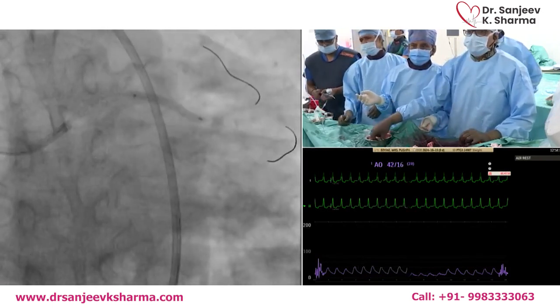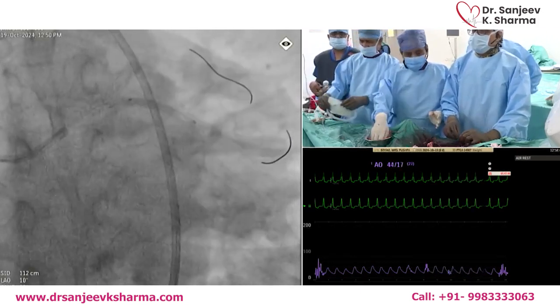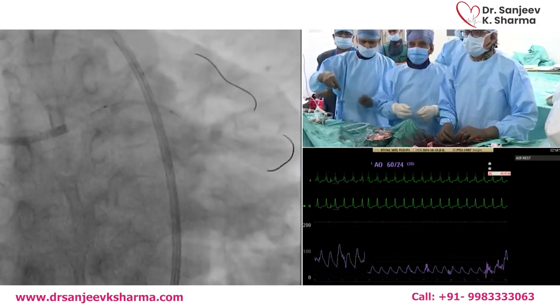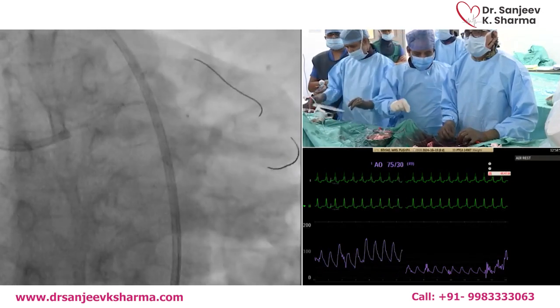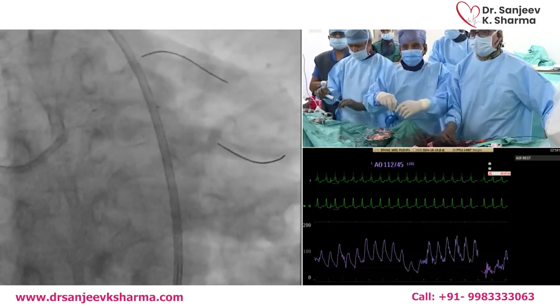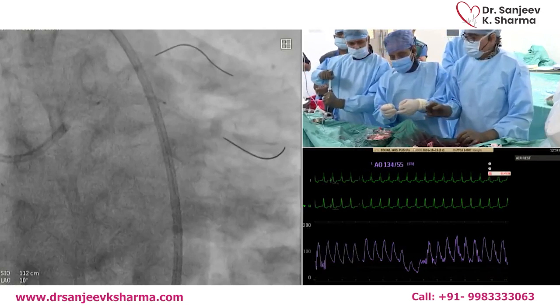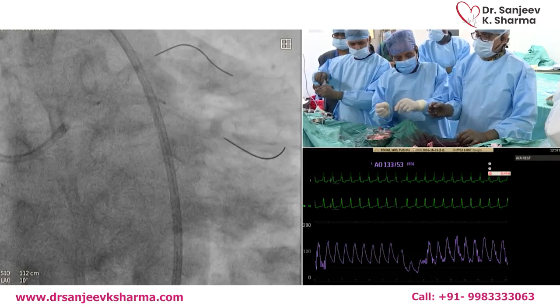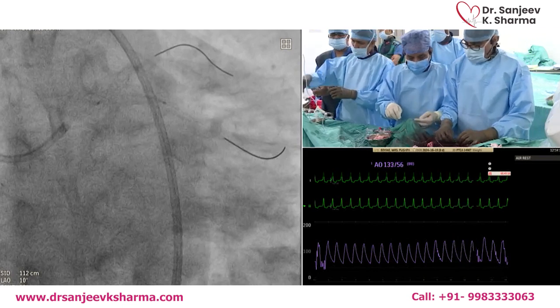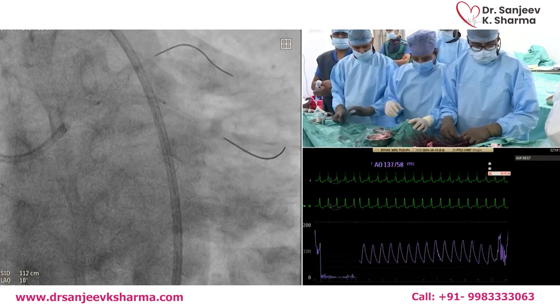Any advantage of doing the POT first in this case? If the crossing is difficult, then we can do it. The point is, once you have done the kissing, you have to re-POT again. So POT, re-POT, a lot of people love it. We are not that hot on it. Actually, if you saw our paper in JACC Interventions on the POT technique, where is the evidence? Remember, in non-left main there was a trial called POT-PRO, and there was actually no advantage. Rather, your kissing was a little better than the POT in terms of stent malposition.